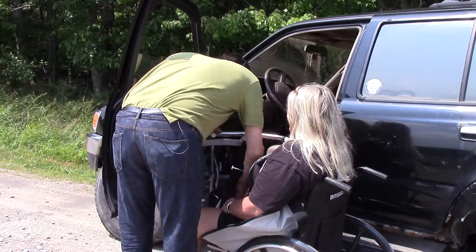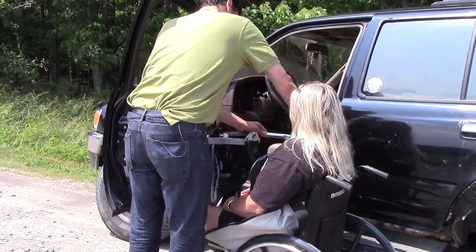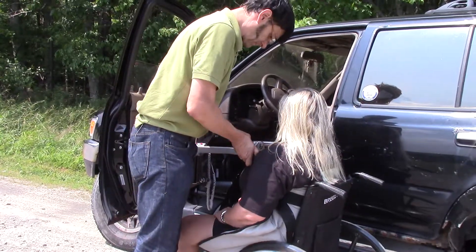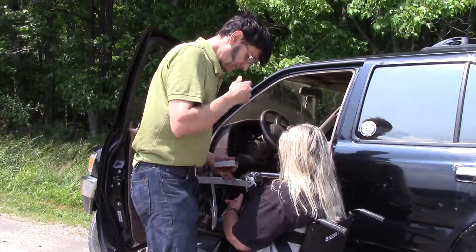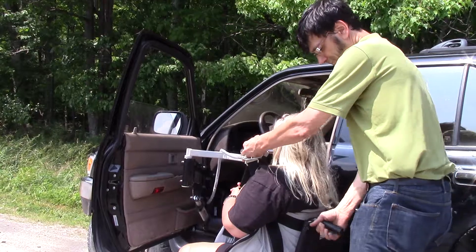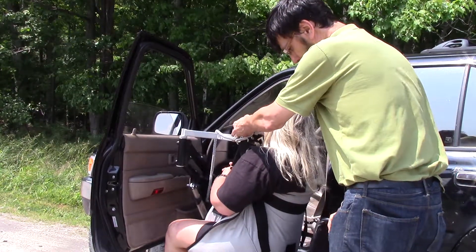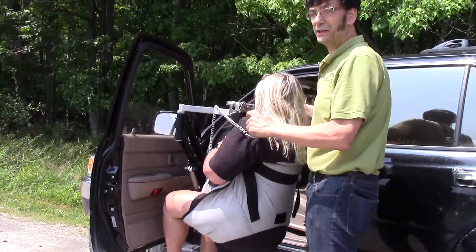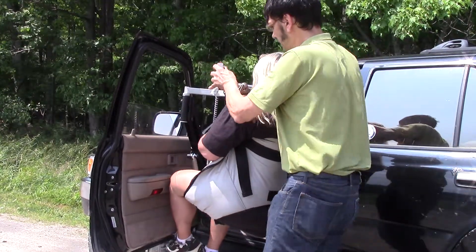First we hook up the leg tabs, then the arm tabs, and we're ready to lift. Once up and off the wheelchair, we move the wheelchair out of the way, go to the fully up position, turn into the vehicle, and do the transfer.